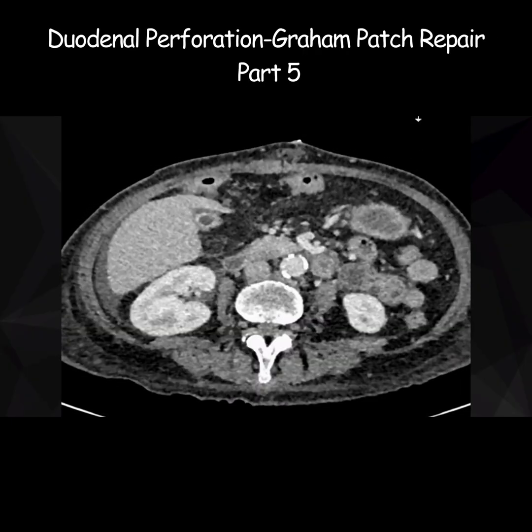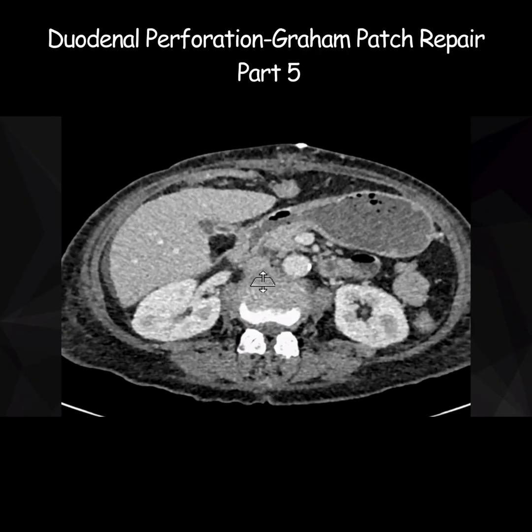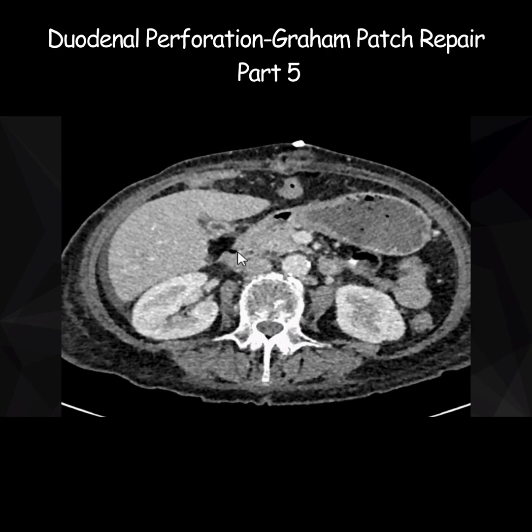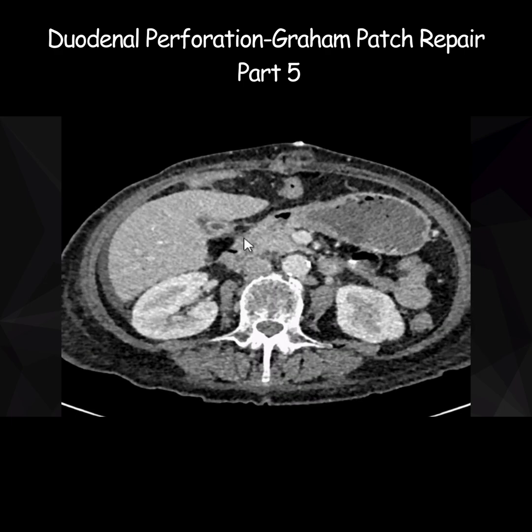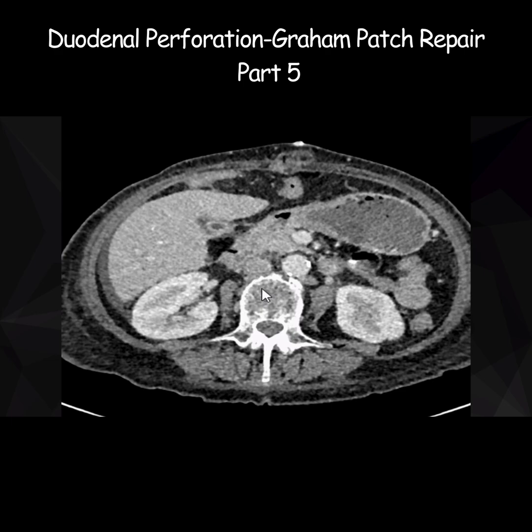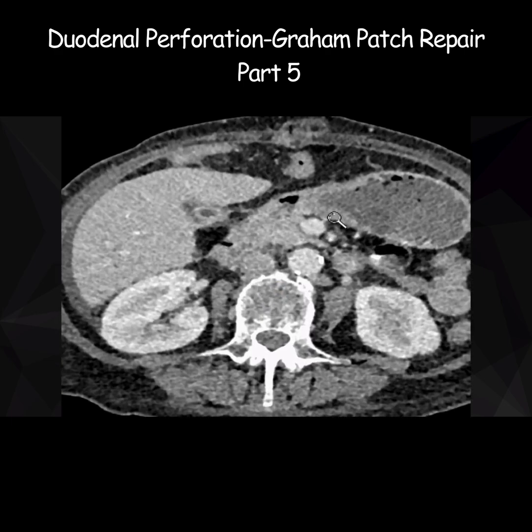Now let's return to the site of perforation again. You can see stomach, D1, and then this is D2. This is the site of perforation. You again see a bit of defect here, but this is very neat and clean compared with the defect we saw previously — this is very sharply demarcated. Is there anything else which you feel is unusual in this case? Let me zoom in on this area for you.